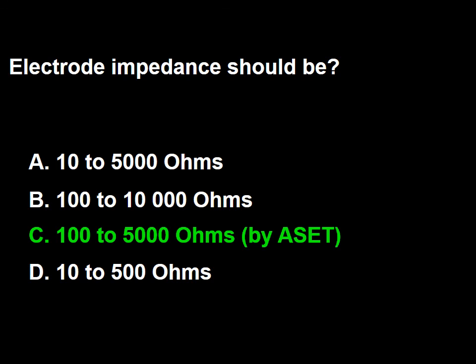It is also important, as recommended by other authors, that the inter-electrode impedance, that is the impedance between all the electrodes connected on one scalp, be within 1,000 ohms of the others.